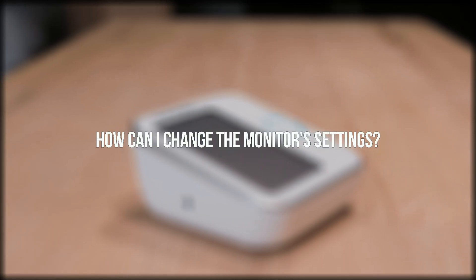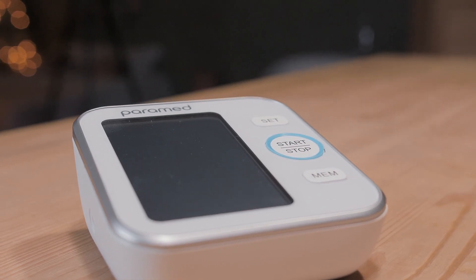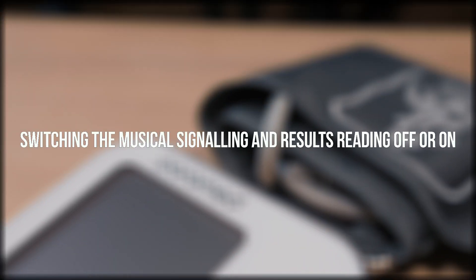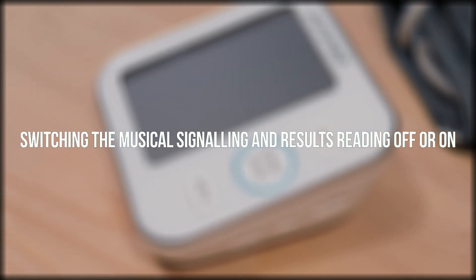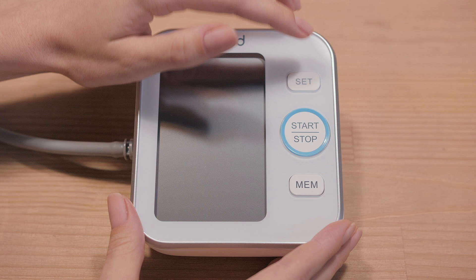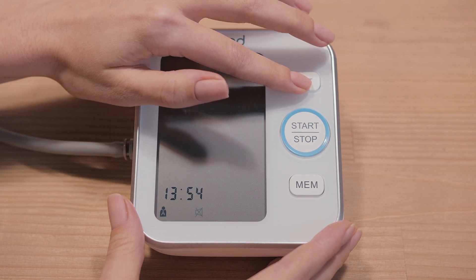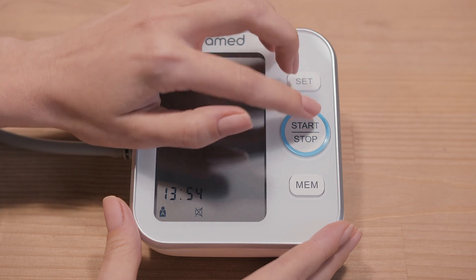How can I change the monitor's settings? For comfortable use of the monitor, we recommend making several changes to the settings. 1. Switching the musical signaling and results reading off or on. While the screen is off, press the Set button. To switch off the volume, press the Set button once again. You will see the symbols for Switched Off Volume on the screen. To switch the volume back on, repeat the steps. To save, click the Off button.